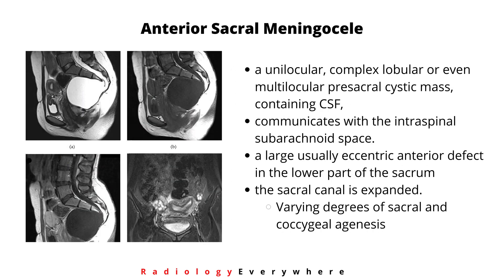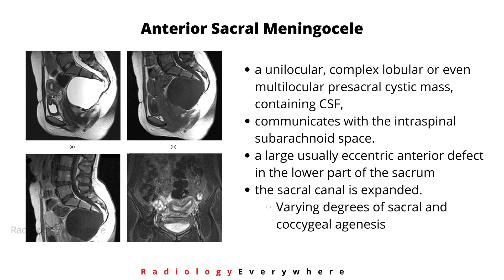These are usually either unilocular, complex lobular, or even multilocular pre-sacral cystic masses containing CSF. This anterior sacral meningocele communicates with the intraspinal subarachnoid space. You can see a large, usually eccentric anterior defect in the lower part of the sacrum.